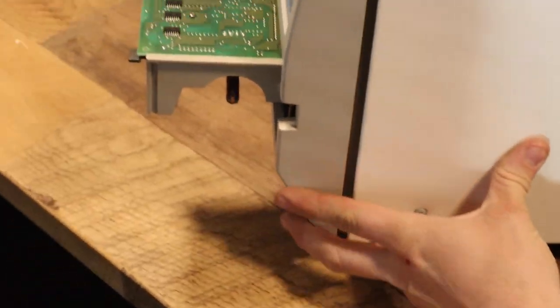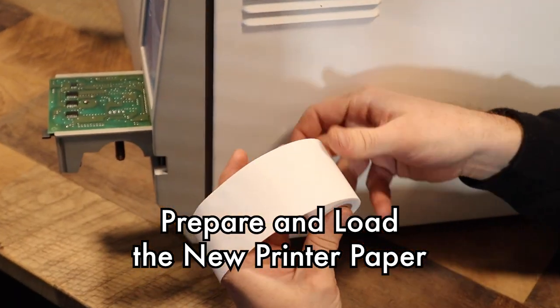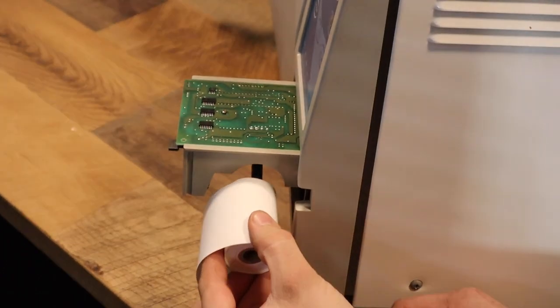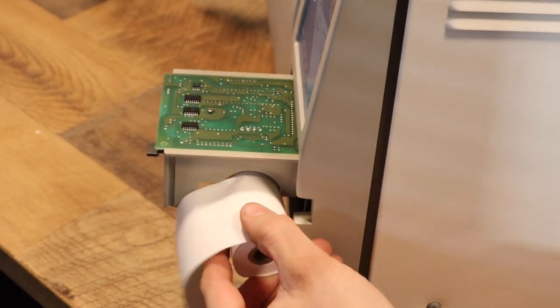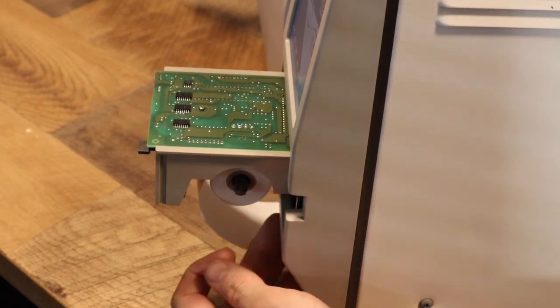Once you have that printer out, we're going to take the new paper and make sure it is rolled over the top and not underneath. With it rolled over the top, we're going to slide that on. If there is a roll, a core that's in there, go ahead and remove that.